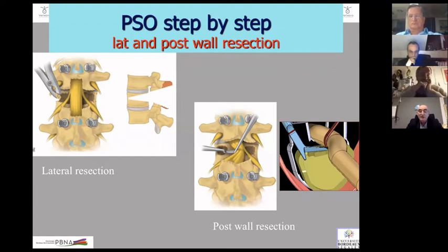And there are always small veins there that you coagulate before. But this osteotome will allow you to do a very nice resection. You use it from one side to the middle, from the other side to the middle, on top, on bottom, and you can do a very nice resection. If you need a very big osteotomy, of course, you increase the size of the resection at this level to do the osteotomy at this level.